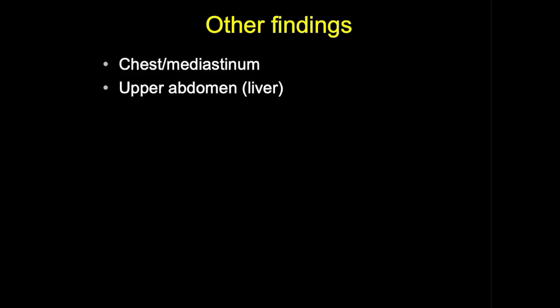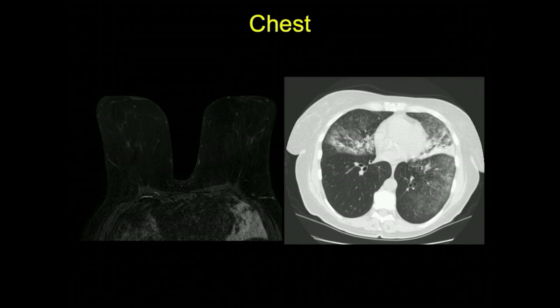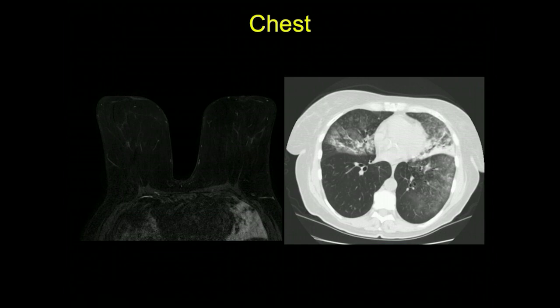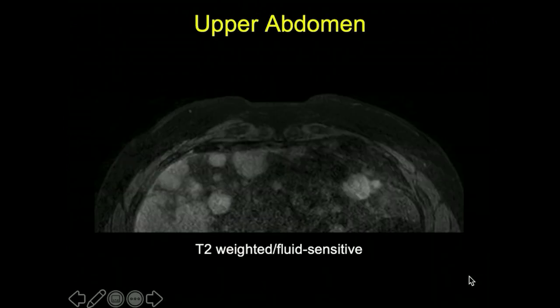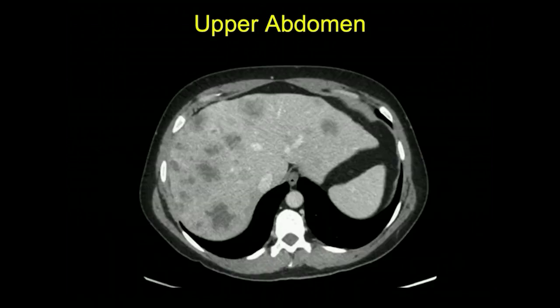Given the larger field of view, it is important to evaluate extramammary findings in the chest, mediastinum, and upper abdomen — particularly the liver. On one breast MRI, left lingular consolidation and right middle lobe involvement were noted on the fluid-sensitive sequence; a subsequent chest CT confirmed bilateral peripheral ground-glass opacities with septal thickening, found to be pulmonary alveolar proteinosis. In another patient with known breast cancer, multiple T2-bright liver masses were found, and CT confirmed multiple hepatic metastases.